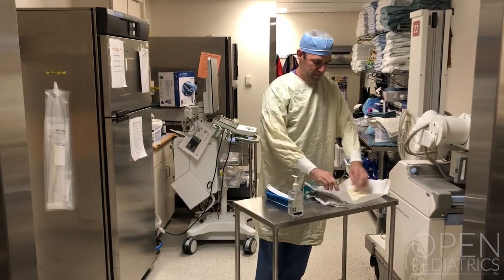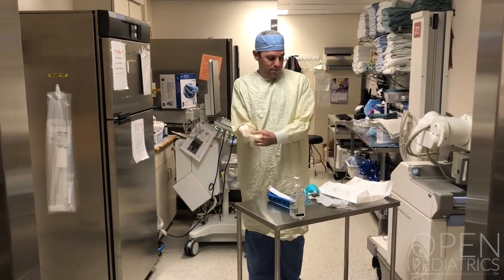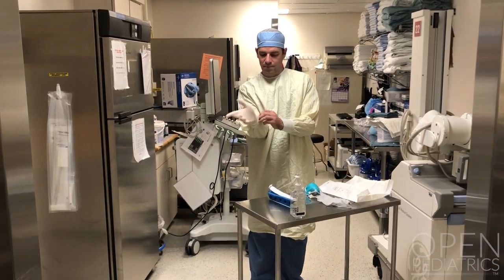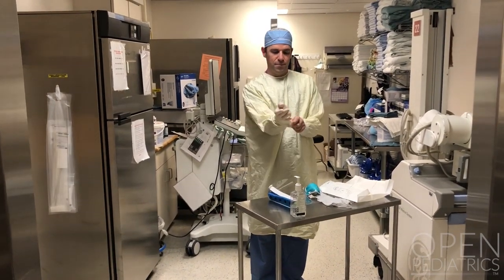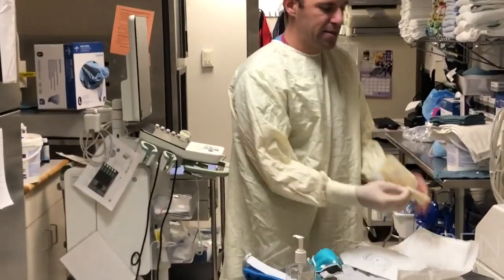Next, don a pair of long cuff surgical gloves. The reason we're using surgical gloves for airway and anesthesia procedures is to be sure that the cuff covers the gown and does not expose your skin.